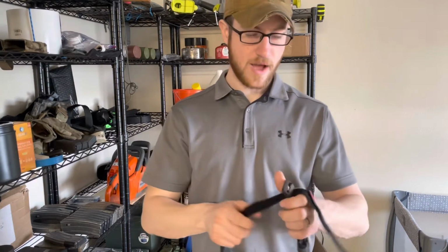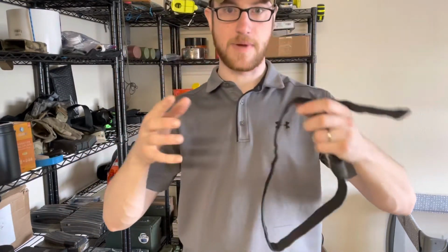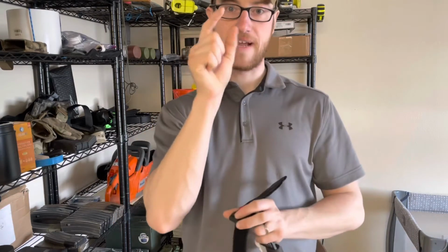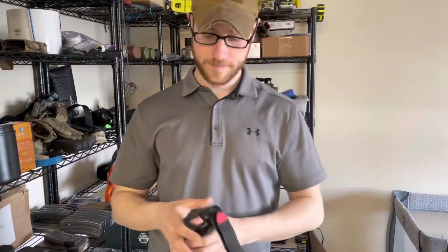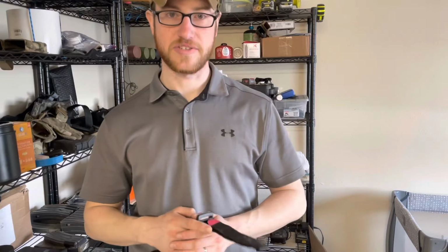Oh, first of all, how this works. This is basically just going to constrict down the muscle, tendons, fat, skin, whatever, on your extremity, be it a leg or an arm, to pinch off the artery against the bone. So similar to how you can kink a garden hose, it's going to compress all the stuff in your leg down to the bone until you can pinch off that artery up against the bone. So pretty simple stuff. That being said, let's get into some demonstrations.